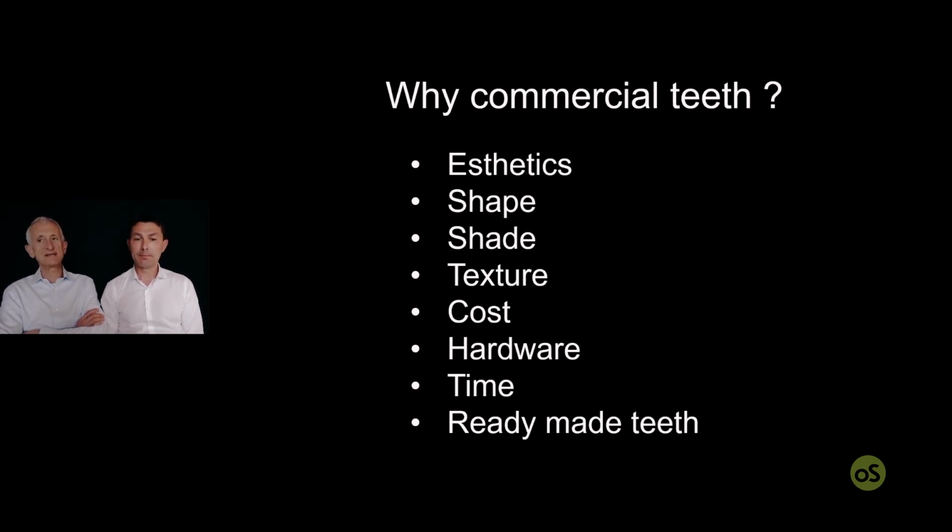So can we say that among the many advantages of using commercial teeth is the quality of the aesthetics? I mean, compared to something that you made yourself with a digital approach. We are not criticizing the digital approach, but my understanding is that there is something ready-made that has a lot of beautiful characteristics that is not so easy to copy and to mimic when it comes to making these teeth, this shell yourself.